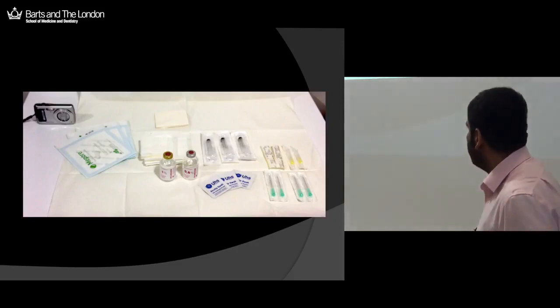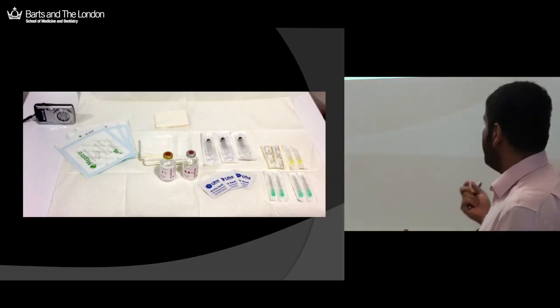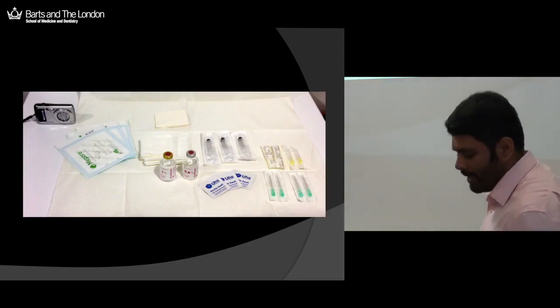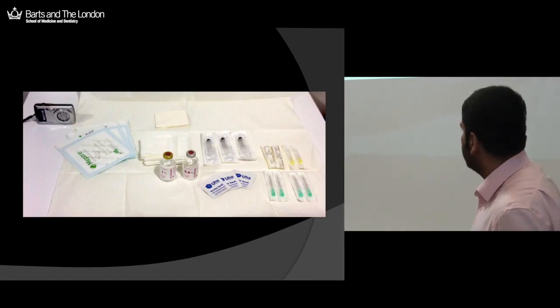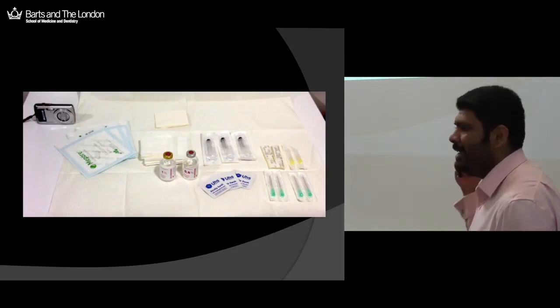This is a typical set tray of equipment that we use to perform it. As you can see, it's very simple, nothing complex here. I'm surprised when I speak to a lot of my colleagues why they don't do it more often, but you know, it's just an easy thing to do.